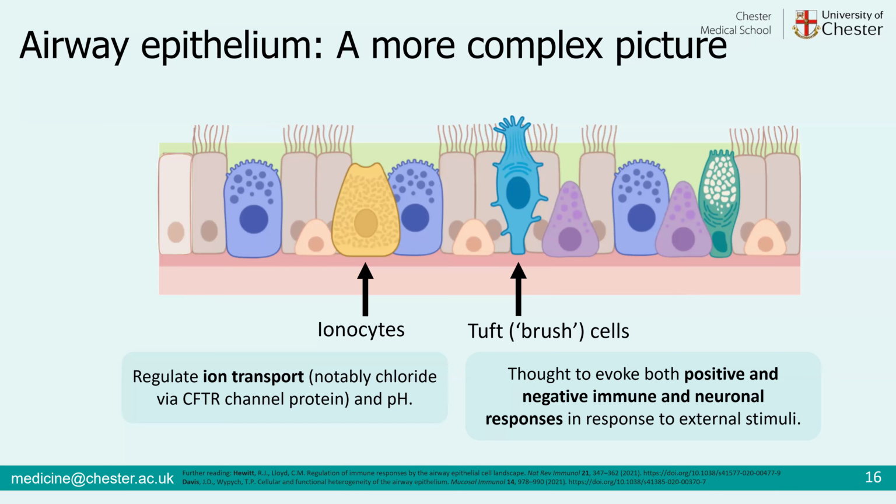So you'll predominantly see the goblet cells, the ciliated cells, the basal cells, and the, what was the other cell? Club cells, thank you. You'll commonly see those mentioned as the respiratory type epithelium cells, but keep in mind they're not the only type of cells. We see that there is a variety of other cells and probably more that will come through research as well.